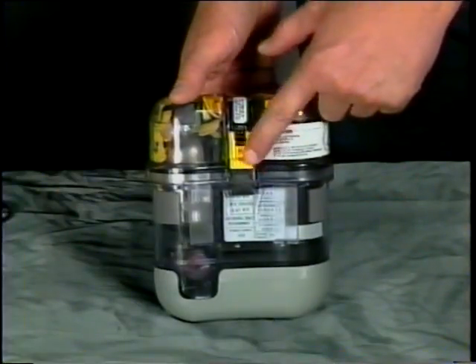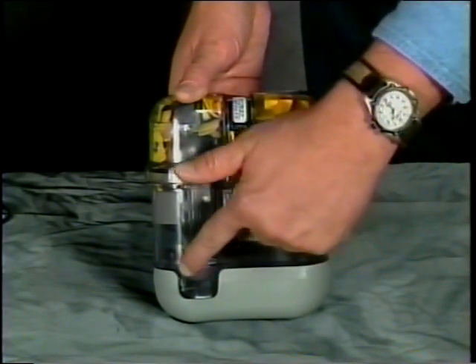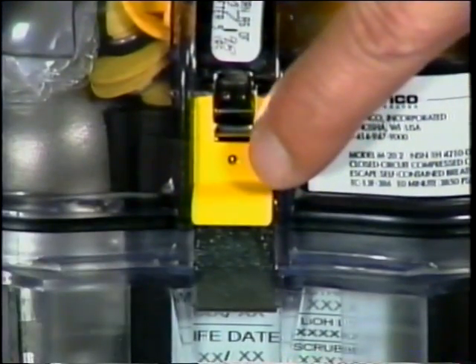Also check for a damaged latch or cover band; dirt, debris, or moisture visible through the case; broken belt loops; or a missing tamper indicating ball.